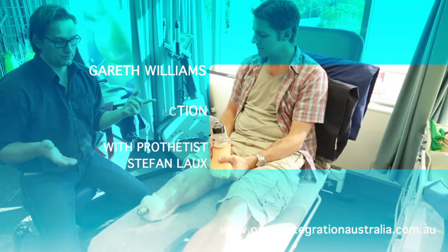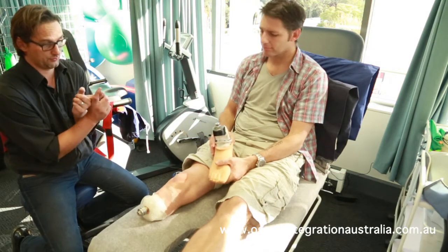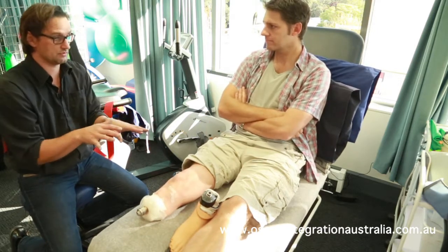If I were you, I would try a couple. I'll tell you what I think is important for you to get out of a foot. One is ground compliance — uneven terrains, but also torsion. And two is energy return.